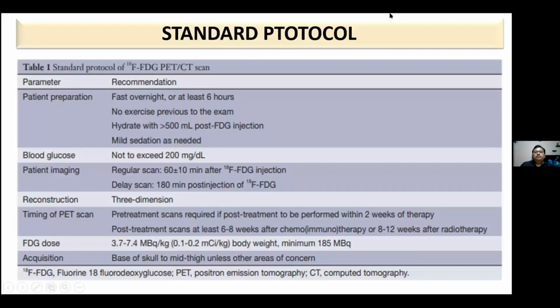Now, going on to the standard protocol. The standard protocol for pediatrics is the same as for adults. For patient preparation, fasting is required overnight, or in case of children, at least for 6 hours. No exercise previous to the exam. So basically, children should not run or be more active physically.